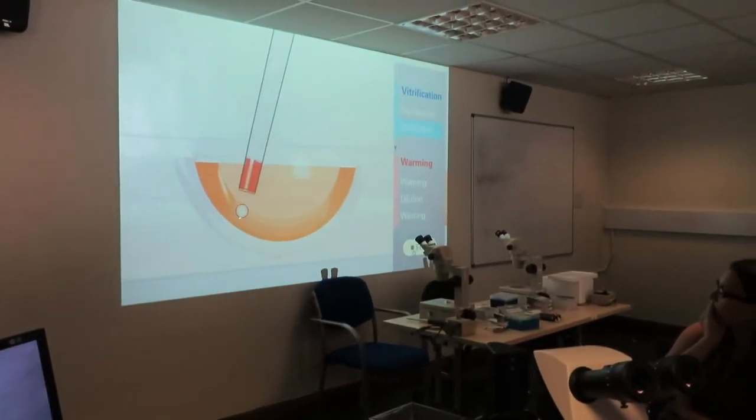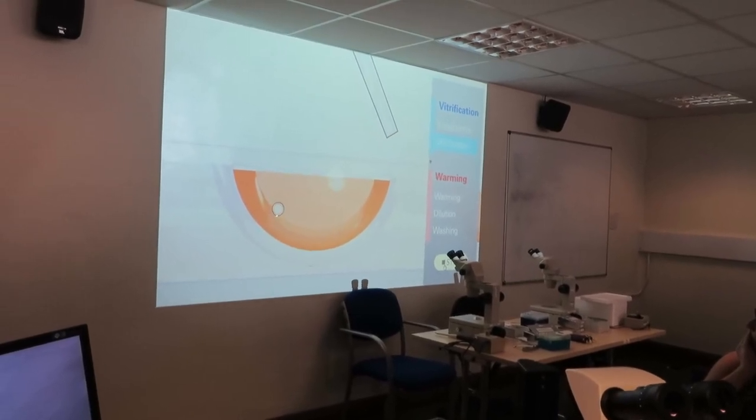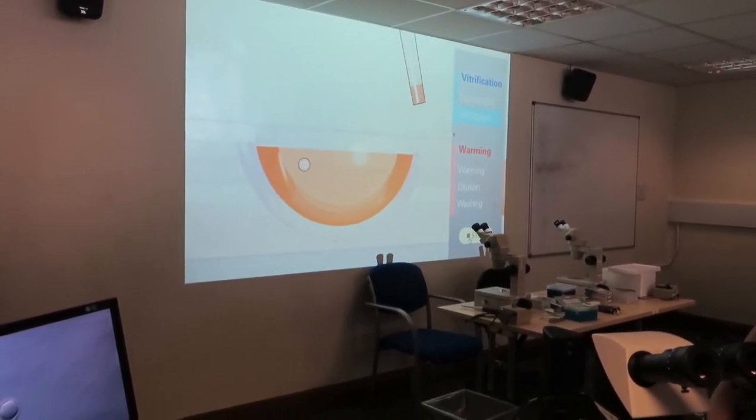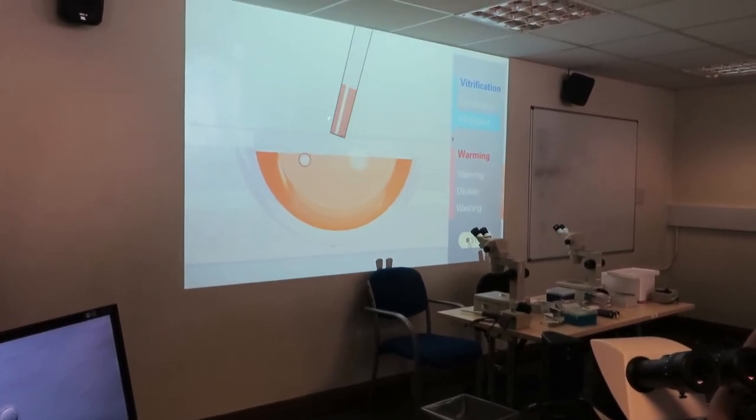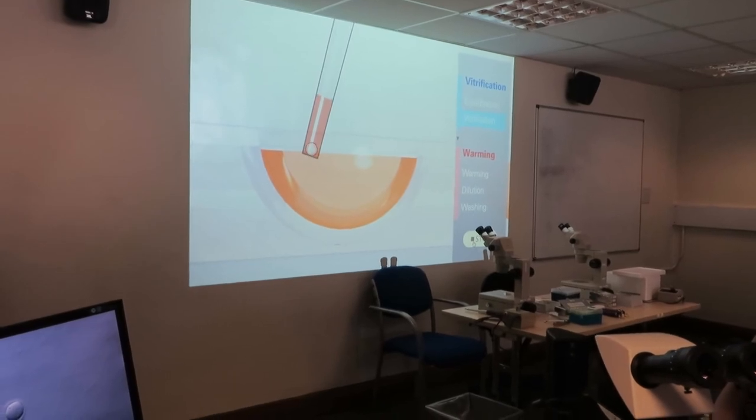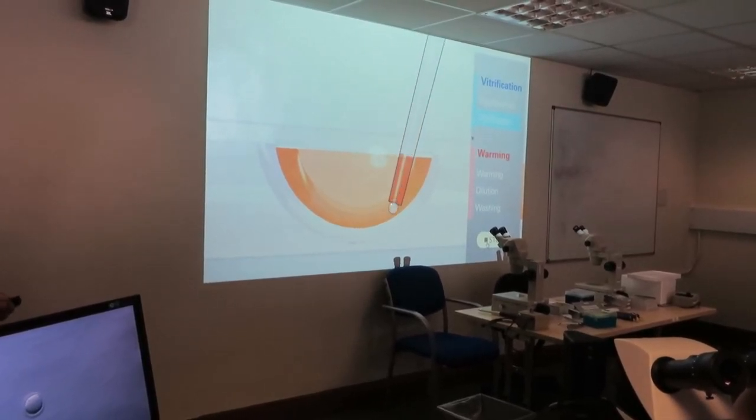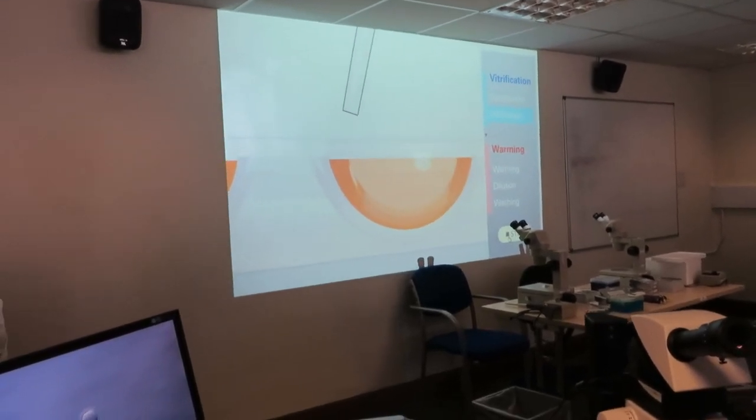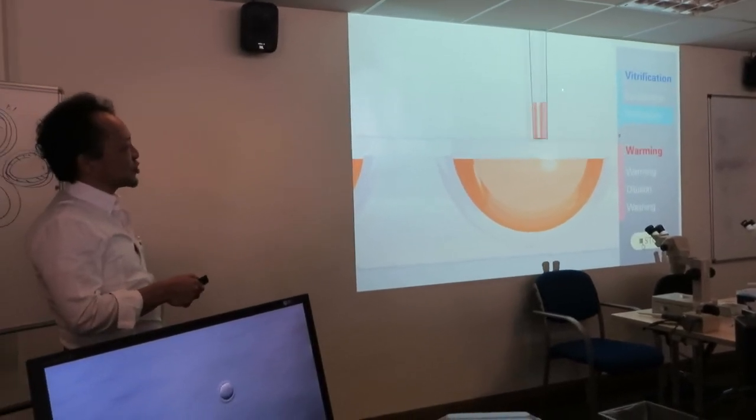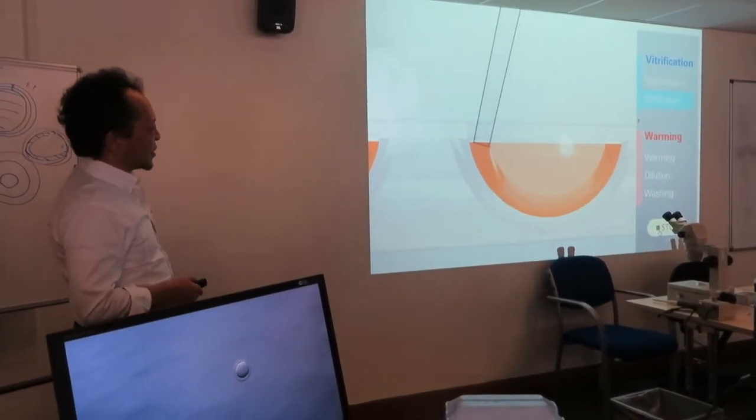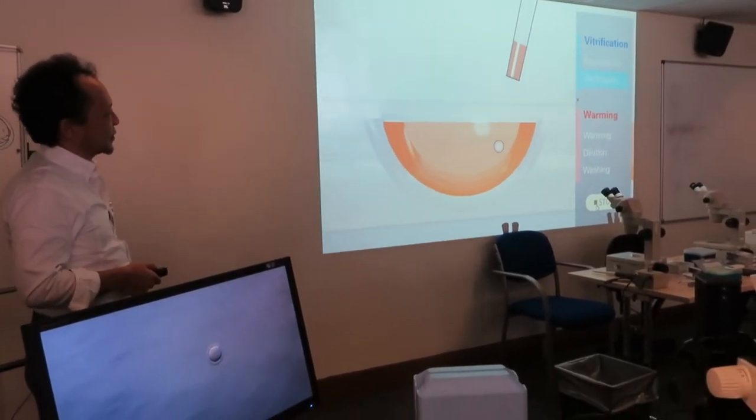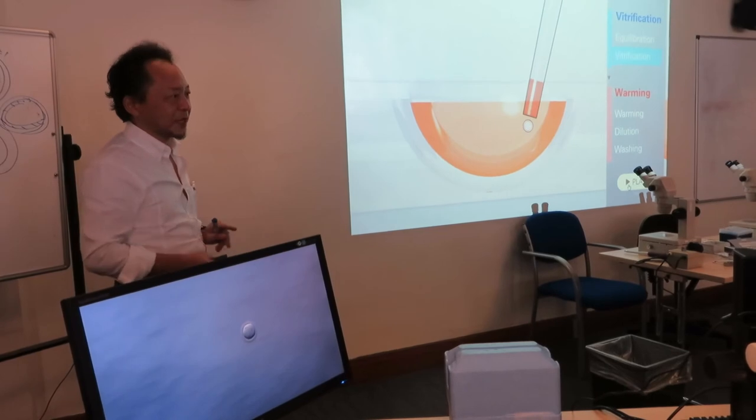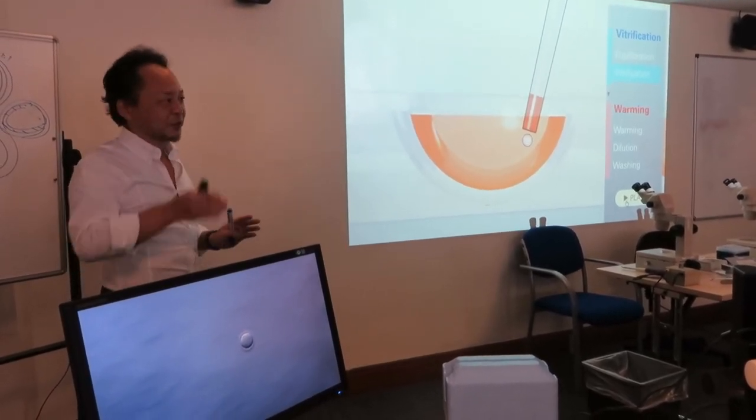We make two shots. First we introduce the pipette here and shoot the oocyte. Then the oocyte immediately floats to the surface. This is heavy solution, this is light solution. Oocytes come with previous solution to the surface. Then we take only the oocyte from the surface and again shoot to the bottom. Then the oocyte slowly floats while changing. The extracellular solution is changing, and the oocyte stops in the middle. If the oocyte stops, it is end of the step. The extracellular solution will be changed automatically. This is mine.